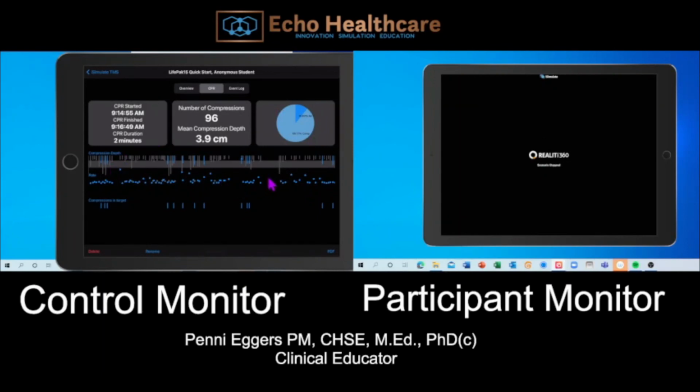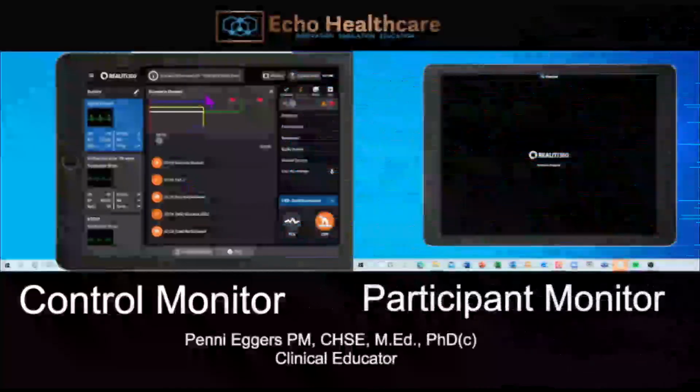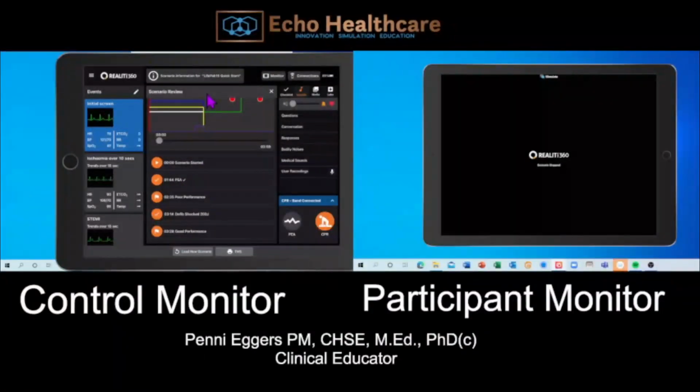And once again, this gives us that graph that we showed on the PDF, where the blue highlight is where my depth was really good. The gray shows my depth either too deep or not deep enough, and then my rate. And that's how you connect your CPR bands and how to use it in your debriefing tool.